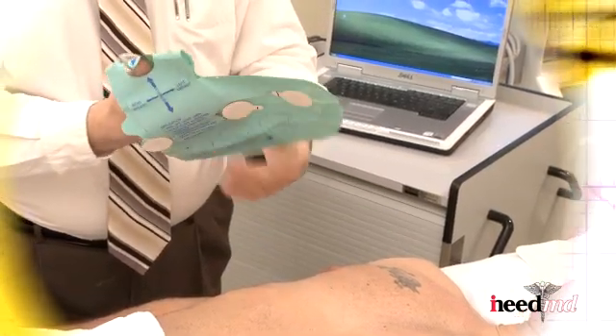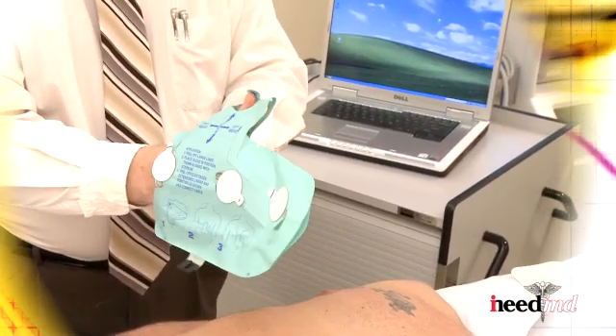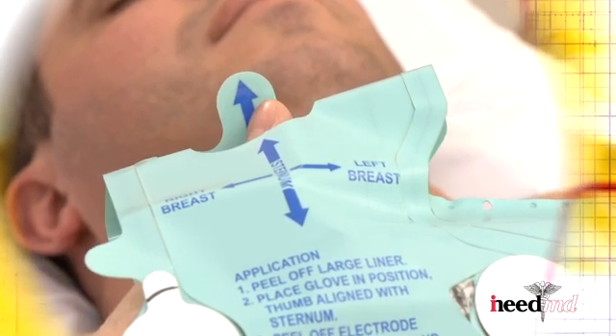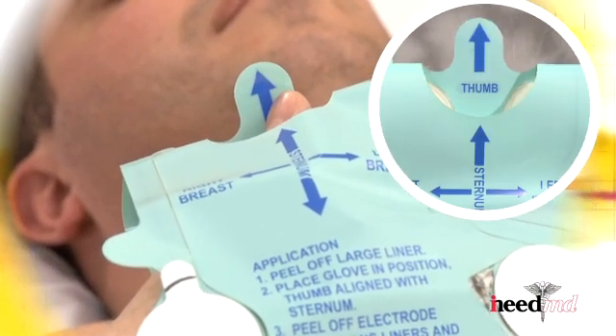Next, you will need to place your right hand into the glove. When placing your right hand into the glove, your thumb is to protrude through the hole over the area marked sternum, along with the arrow signs in the glove.